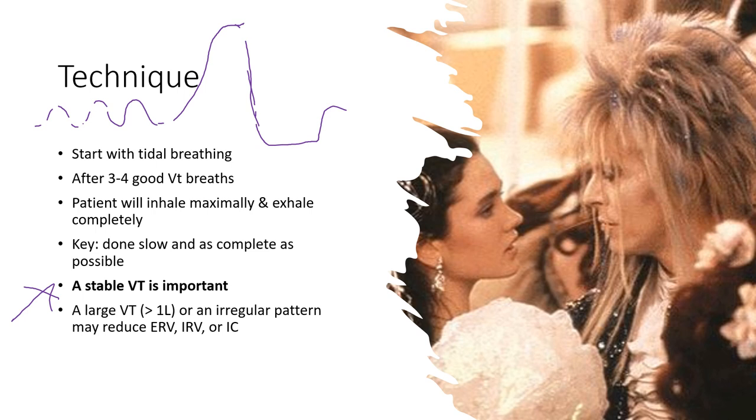stable tidal volume, because what if you're breathing at really deep tidal volumes, right? Someone's looking at you breathing, you're not going to breathe normal, right? Tell someone to breathe normal and stare at them. Are they going to breathe normal? No, they're going to breathe abnormal if you tell them to do that. Well, same thing when you're doing a pulmonary function test.